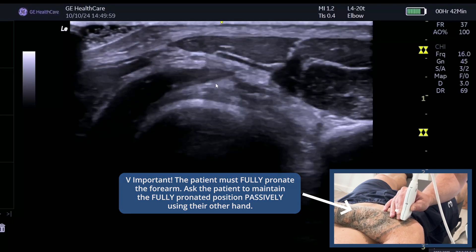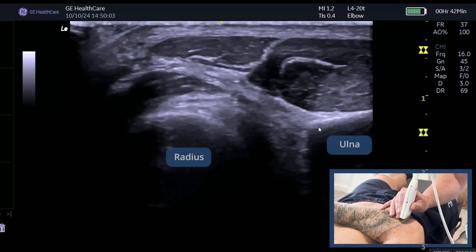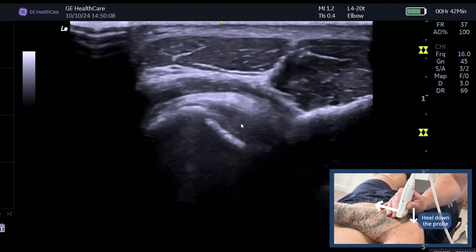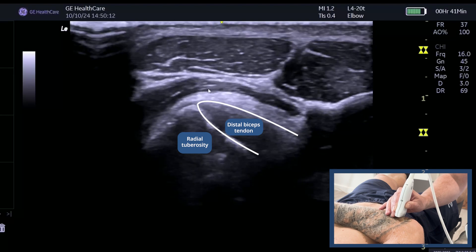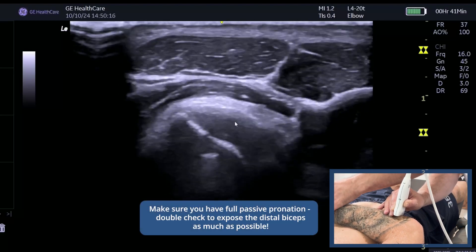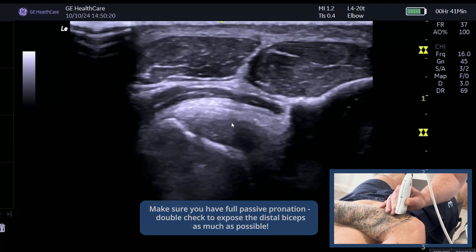As we slide down, keep the bone bright and you'll see the radius and the ulna. Heel down the probe and as you come further down, you'll start to see the distal biceps tendon here, with the supinator muscle on top. Asking your patient to pronate as much as possible will give you as much of the distal biceps as you can.